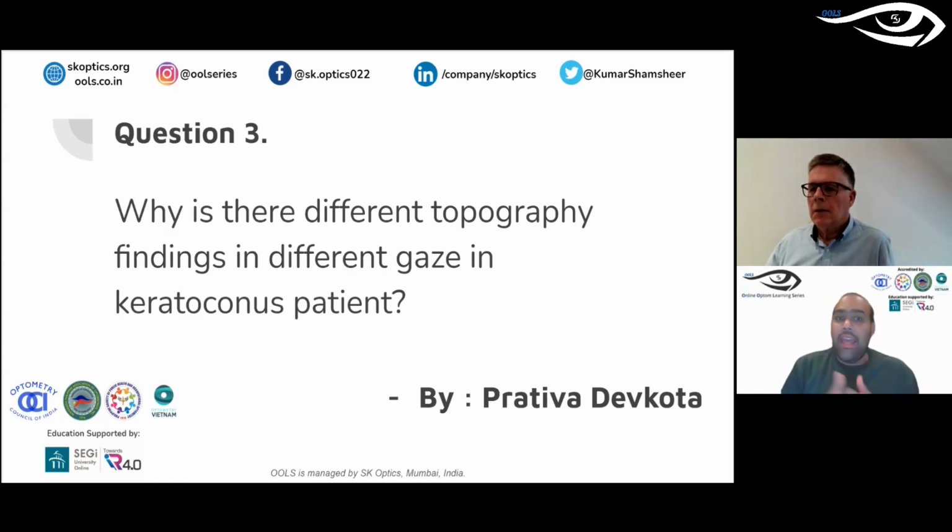But if you are into a diagnostic clinic, probably a Pentacam would be better to look at the posterior cornea, and also because some of the questions which I just skipped were about posterior keratoconus and keratoglobus. So for that you need more advanced instrumentation. So the purpose is really important. I totally agree with what you said. Know what you want to do.